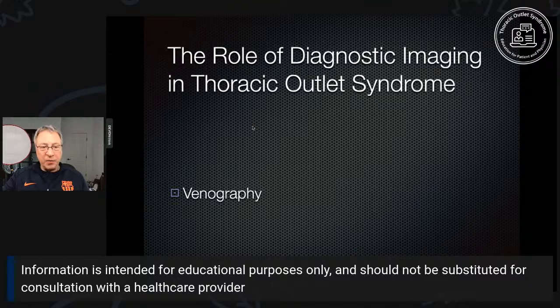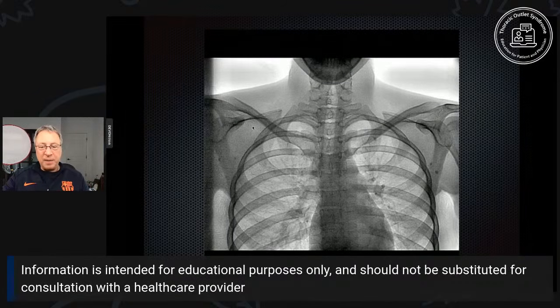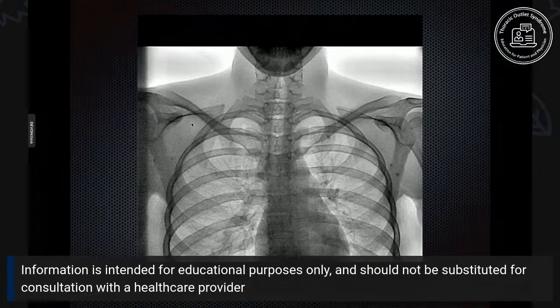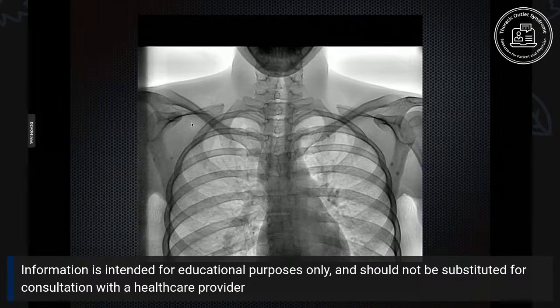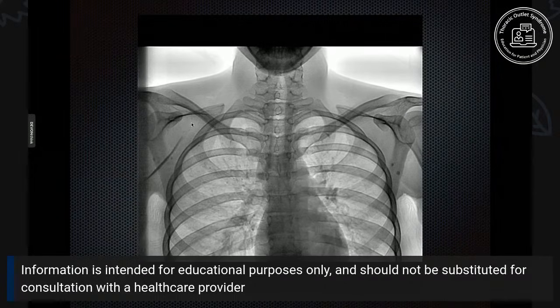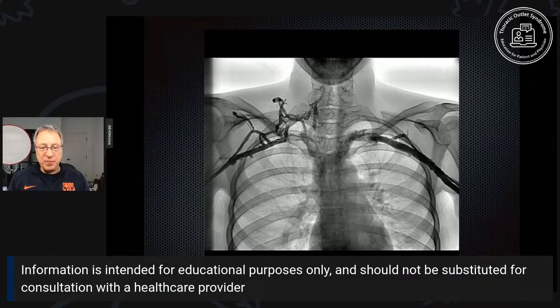It's called venography. Now, I got from a Dr. Paul Gamboa in Argentina a really awesome pic. This is actually a video of venography. Now, this looks like a chest X-ray. What you're going to see is they've actually put little catheters into the veins of the patient in the crook of each elbow, and they're going to inject X-ray dye or contrast. And what you're going to see, the beating heart, and slowly the blood from the veins is going to come back towards the heart. All right, and you can see it flow in.